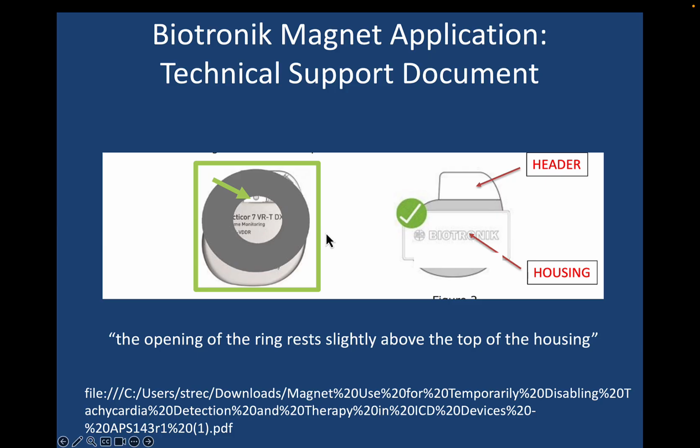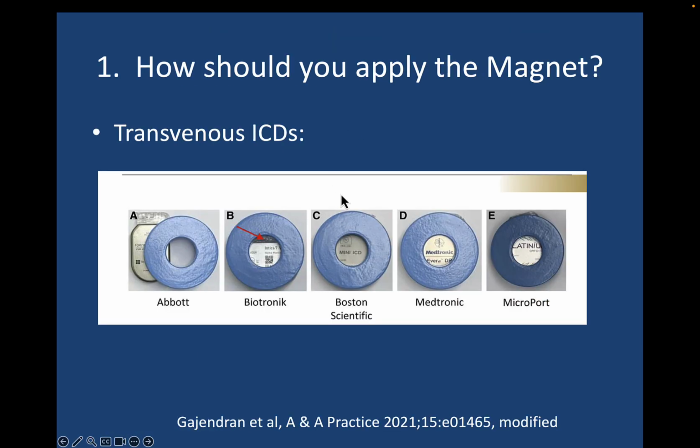And what Biotronik says is to put the magnet in such a manner so that the magnet's opening covers a little bit of the header as opposed to being right in the center of the housing. Boston Scientific transvenous ICDs, Medtronic transvenous ICDs, and MicroPort ICDs just require the magnet to be over the center of the housing.